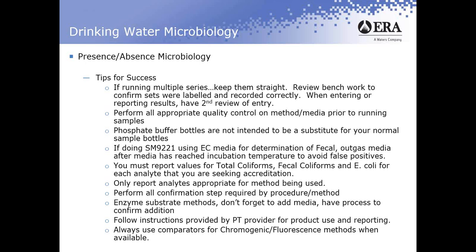So follow the instructions provided by the PT provider for the product use and reporting. You may see different instructions from different providers on how they want data reported or how you use the product. Read the instructions before you get going. You don't want to have a failure simply because you didn't follow the instructions that you were provided.